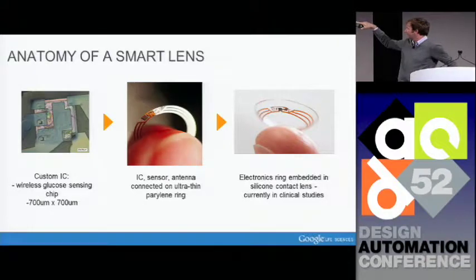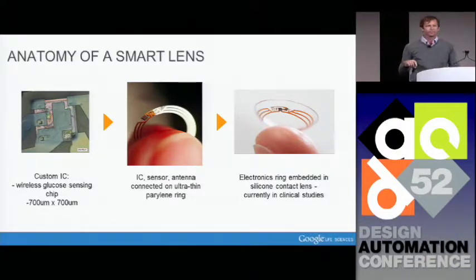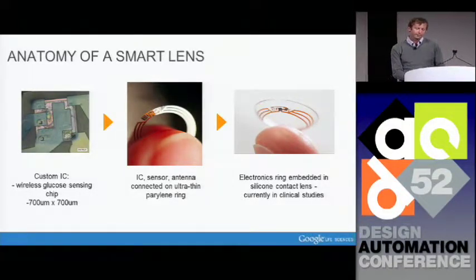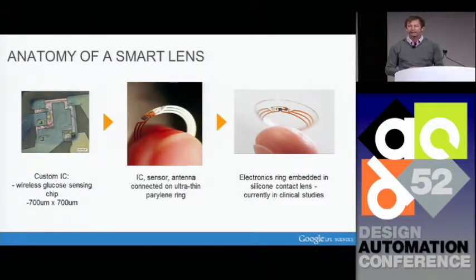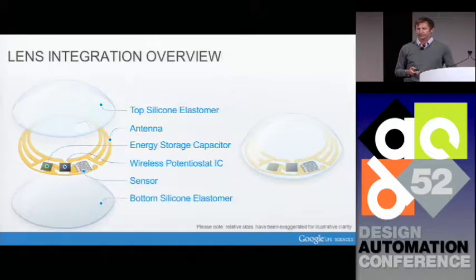One important thing to notice here is that the overall volume of the stuff in the contact lens that is not regular contact lens material is about 3%. The other 97% of the volume is standard contact lens material that does vision correction and everything else. And that's pretty exciting. It means that even in something as small as a contact lens, there's actually a lot of real estate available. If we're only using 3% of the volume of the contact lens for all of this functionality, then this has a lot of potential for other types of devices that you would typically wear. And this addition of a very small volume is probably going to be imperceptible.